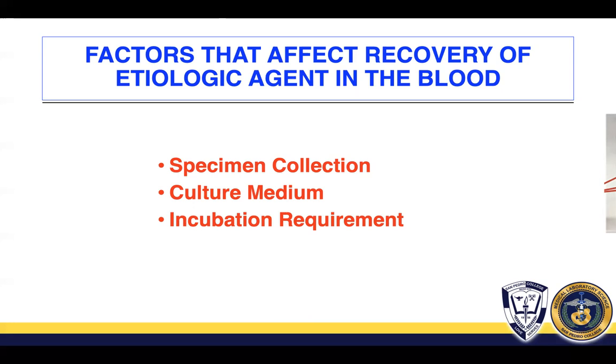Next, culture media. Culture media may contain nutrients, chemicals that would enhance the growth of one organism. There are also inhibitory agents that would inhibit the growth of other organisms. Then we have incubation requirements. So this would include temperature and duration, or length of incubation.